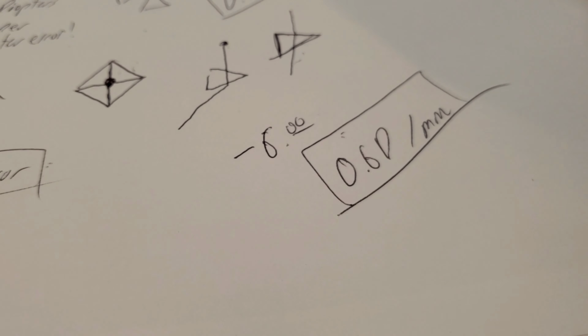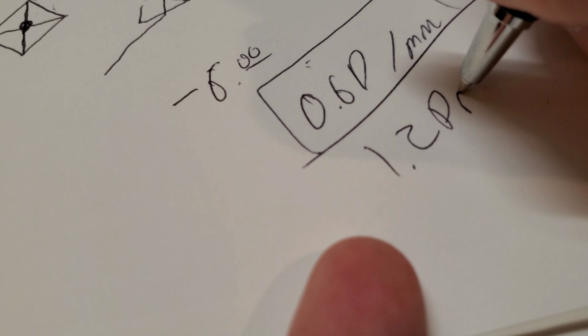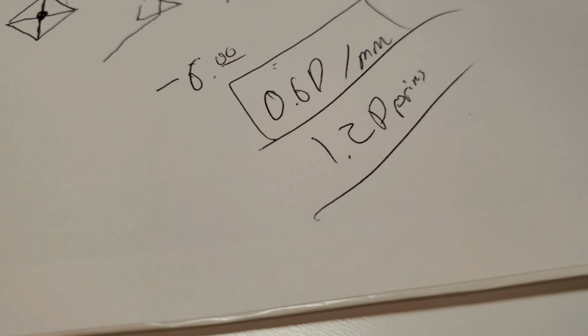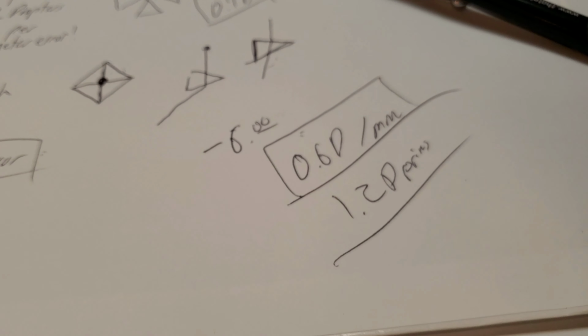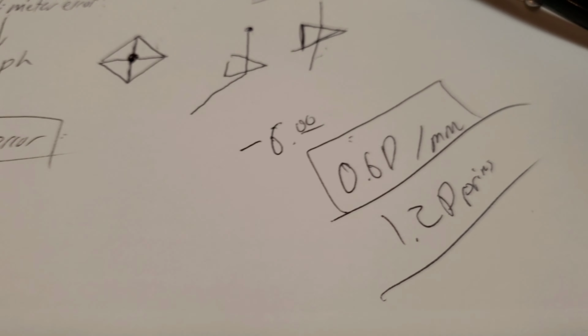Now, if you're off even a millimeter in each eye, isn't that fun? A whole diopter and a quarter of induced prism now. Depending on the direction, this can be a good or a bad thing.